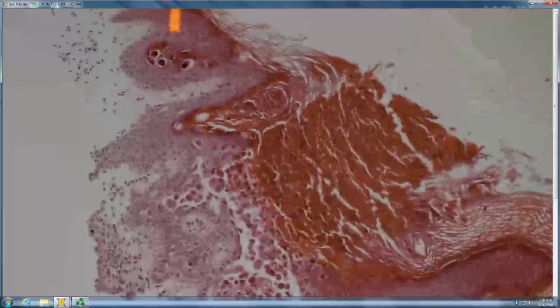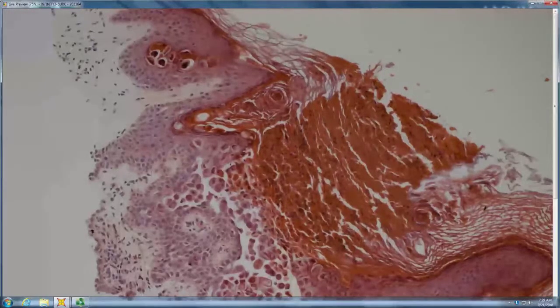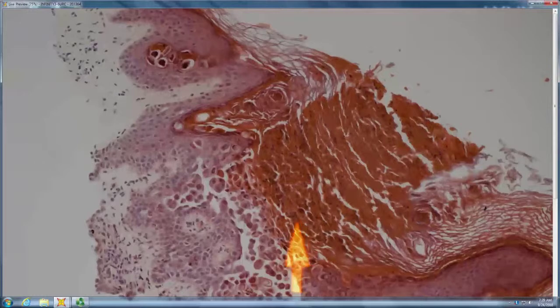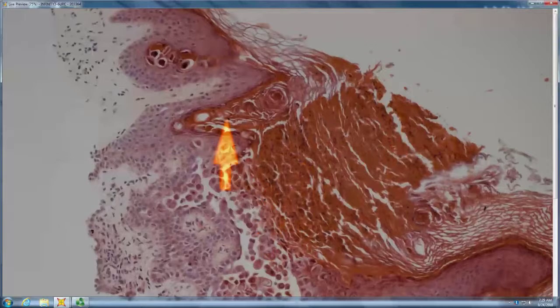We have a lot of corps ronds, right? Grover's, Darier's. Yeah, this is more a Grover's Darier's pattern. So how it differs, this pile of corps ronds that you have here of dyskeratotic cells, you'd never get in Hailey. So that's more a Darier's Grover's pattern to have real stacks of dyskeratotic cells.